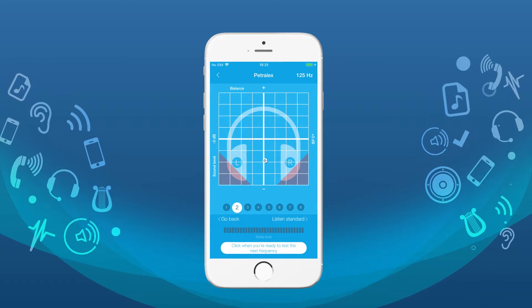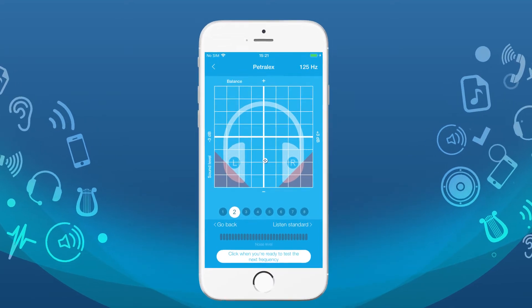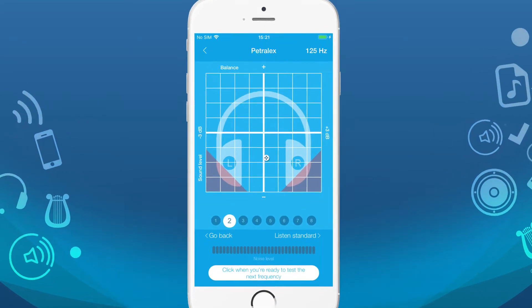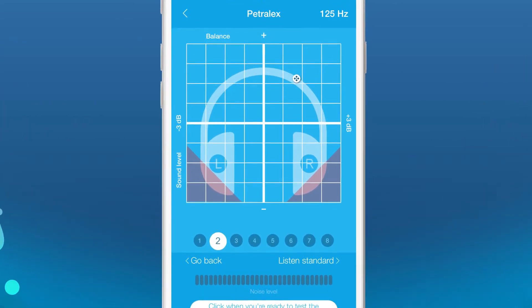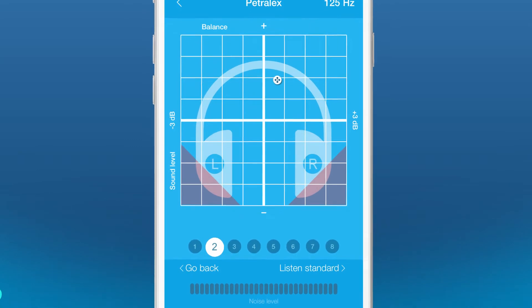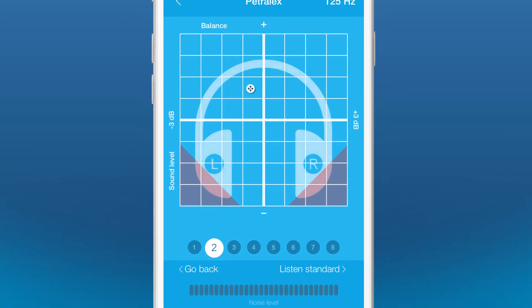Be careful, don't move the cursor too abruptly. Moving the cursor slowly, set the limiting level of perception for each frequency.